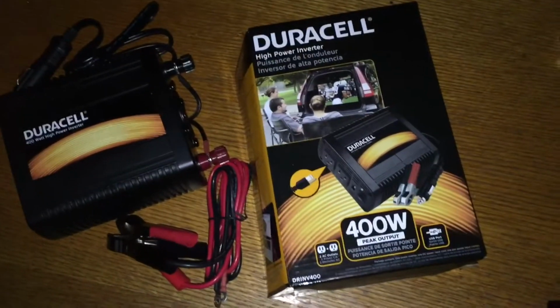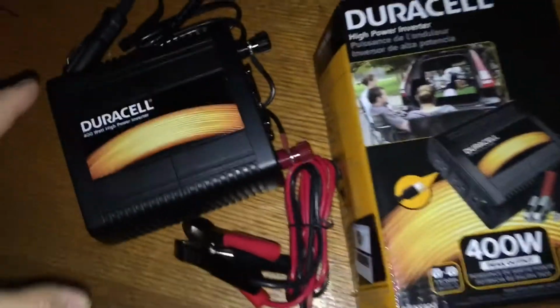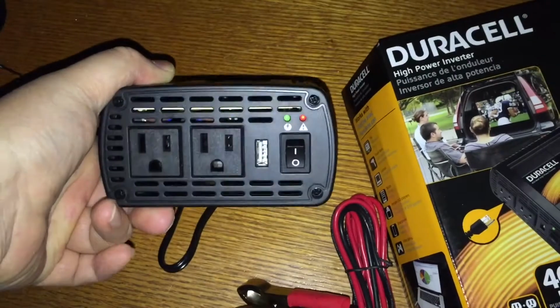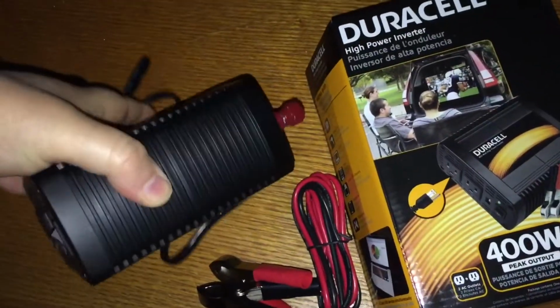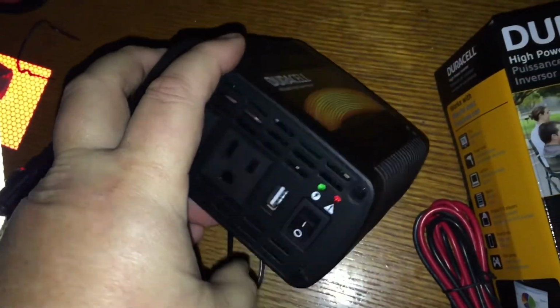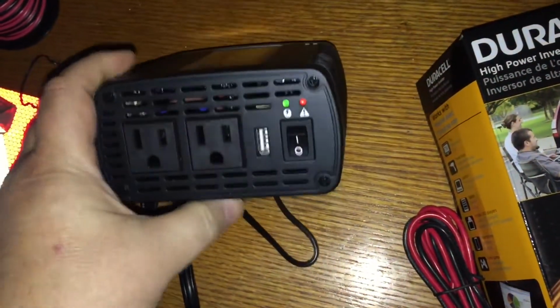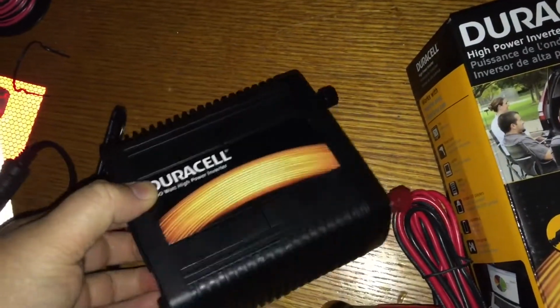Well, one way to do it is to get yourself an inverter. Basically, it changes your DC power into AC power. Now, there's two ways you can do it. This is a Duracell high peak inverter. It's 400 watts. It's very small. As you can tell by my hand, it's about 2 3/4 high, about 5 3/4 length.